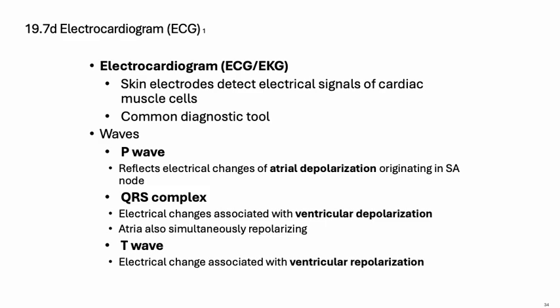The second major form that you'll see is called the QRS complex, right? So the QRS complex represents ventricular depolarization, right? So now we're in the bottom chambers, which are our ventricles, and this is the contraction of those ventricles, right? So this is logically going to follow after our P wave, after our atrial depolarization, right? So our atria contract, blood is moving down into our ventricles, and then you have your QRS complex, where your ventricles contract.